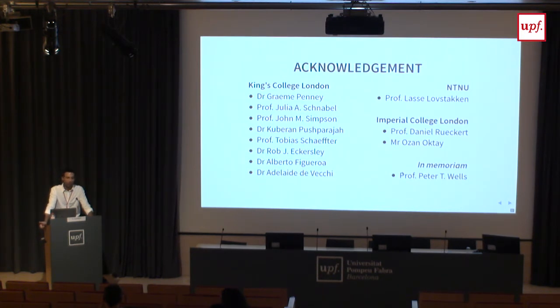So that's one thing. The other thing is if you want to compare them point-wise, so this vector with this vector and so on over the entire image, which might be more interesting, then you have to solve first the problem of aligning MR and ultrasound. And that is very complicated.